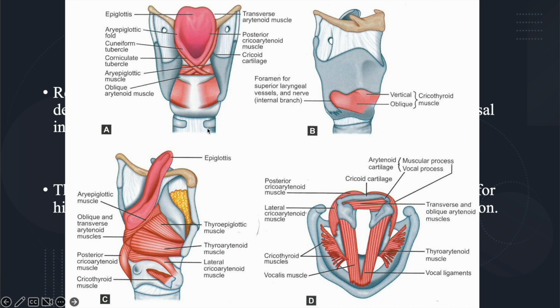So in the cricothyroid membrane, you introduce your guide, and it's similar to a bougie, a little thinner, but it does the same job. You enter your guide in the cricothyroid membrane, and it goes up instead of down. It goes up into the larynx, up through the epiglottis, past the vocal cords, up into the oral pharynx, out of the mouth.